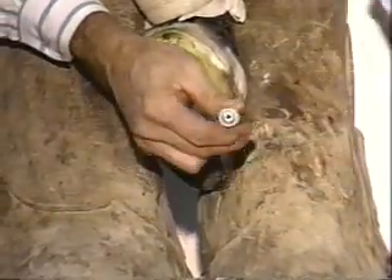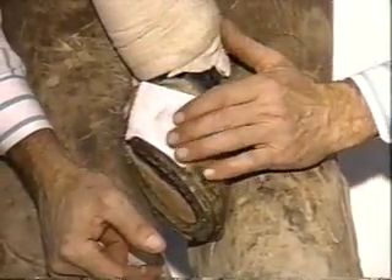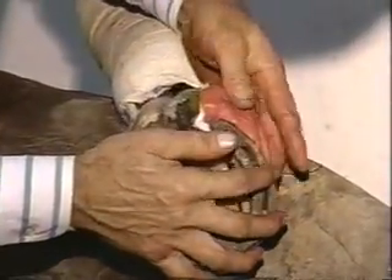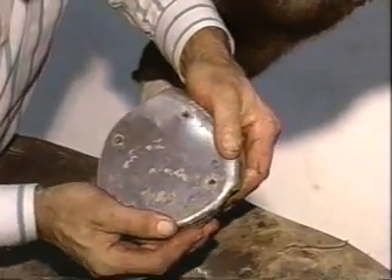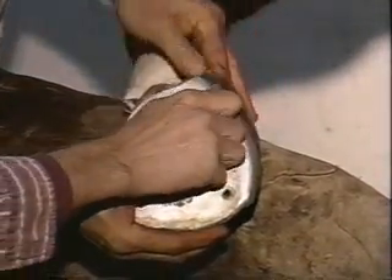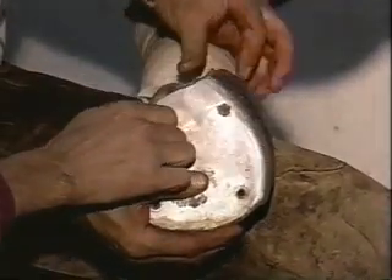I will just put a slight covering over the area — one piece of gauze. You don't need much bulk up there. Simply place it over the area, put the plate on, and bring it in to meet the alignment of your holes. This is very important: if you do not do this early in the setup stage, you don't have the uniform pressure that you were desiring.